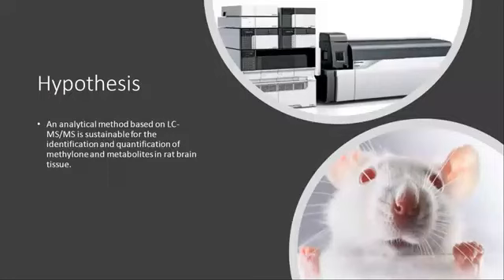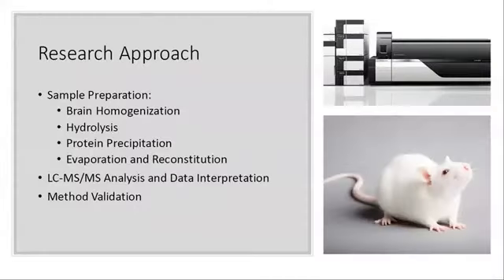For this project specifically, my goal has been to develop and validate a reliable analytical method based on LCMS-MS, which is a very well-known analytical technique for the quantitative analysis of multiple compounds. So this method not only seeks to identify and quantify methylone and metabolites in rat brain tissue, but it can also be used as a tool to study the pharmacological behavior of this drug in the brain.